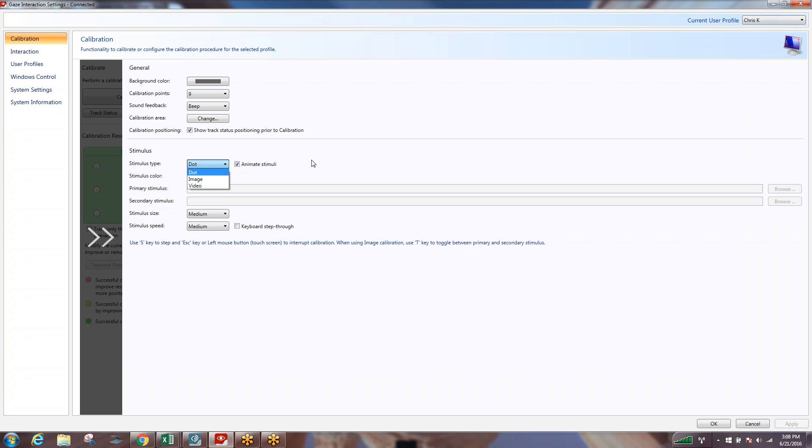We may want to change the stimulus from a dot to maybe an image or a video. It's very common to put an image of something motivating to that customer — maybe a family member, a favorite cartoon, a favorite car — something that's going to allow them to want to follow that around the screen more than just a simple dot. You can also adjust the stimulus size, speed, and potentially use keyboard step through. We're going to keep it pretty basic and I'm not going to change anything — nine calibration points, leaving everything else as is from the factory.